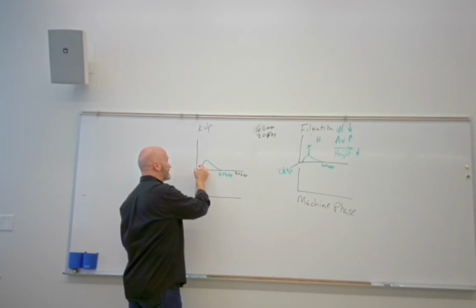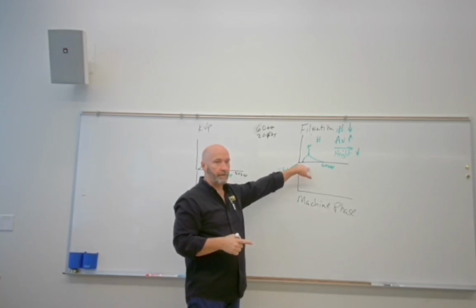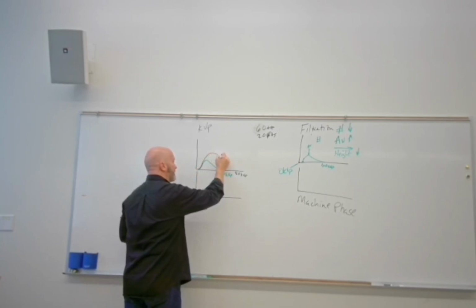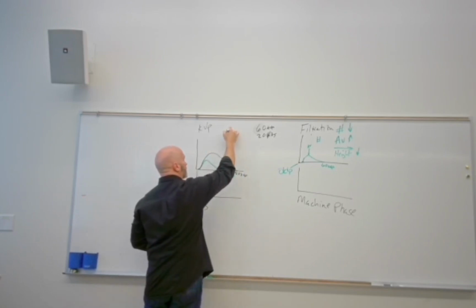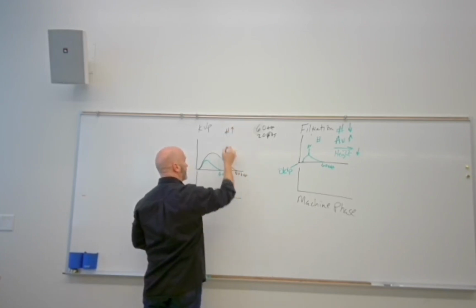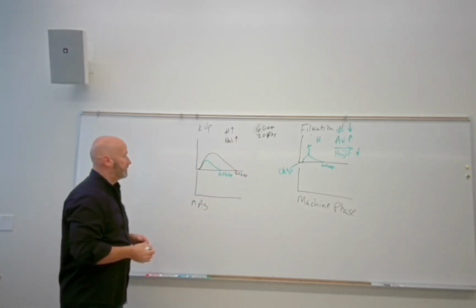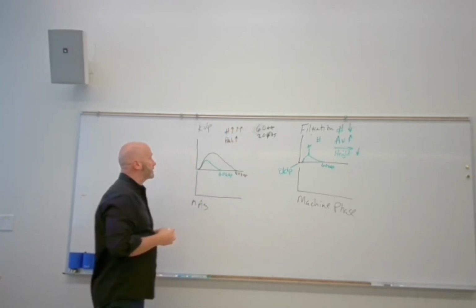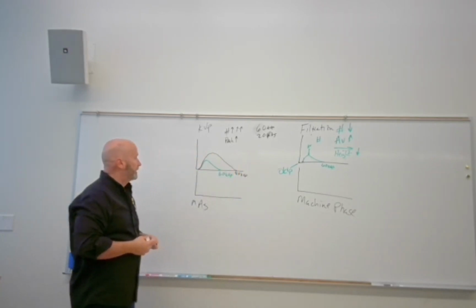But what we're going to get is our minimum energy remains the same, because our minimum energy is only controlled by filtration, right? So it comes off in exactly the same spot, but we get this massive change in what's under here. Numbers, right? So numbers increase. Our peak energy increases. We went from 60 kVp to 80 kVp. We get a massive change in numbers. We get a change in peak energy, right?